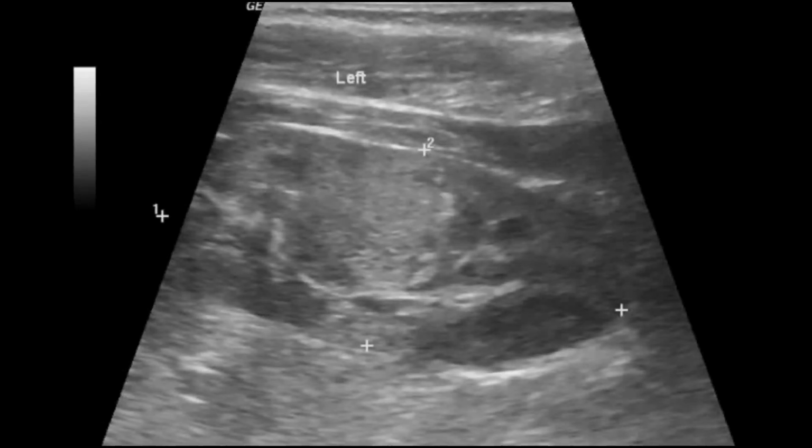Another image for nephroblastoma, Wilms tumor, but here one important point is worth noting: so far as the margins are concerned, it is slightly merged with the parenchyma, and it may mimic the cortical part of the kidney.